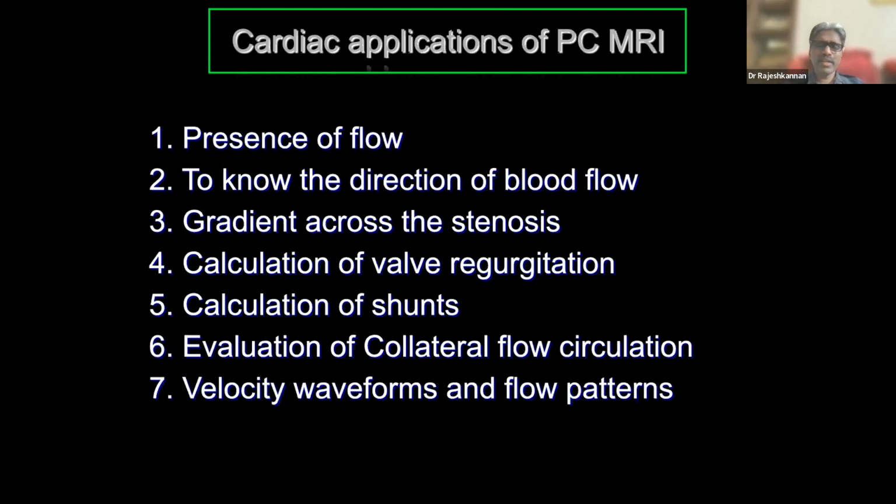Whereas only when you are doing complex flows like post Fontan studies, then we usually do a free breathing sequence, and each level of this free breathing sequence will take about 40 to 60 seconds, where we may have to do more than 12 or 15 vessels. So that itself usually will take about 15 to 20 minutes.